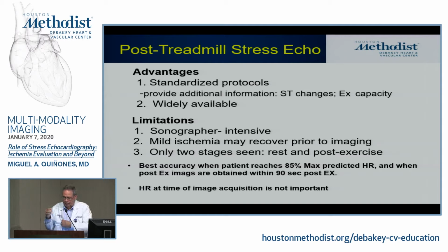to have an adequate test. Now, very importantly, I get off the treadmill, I get on the stretcher, you guys start imaging, and my heart rate now is 100. Does that make the stress echo bad? No, because what's important is what I reached during the treadmill. There are some people that recover very nicely, and within 60 seconds, they're down to 100. Don't worry about it. I sometimes see people saying the patient did not have adequate heart rate because at the time of imaging, it was 100. No, it's what they reached.